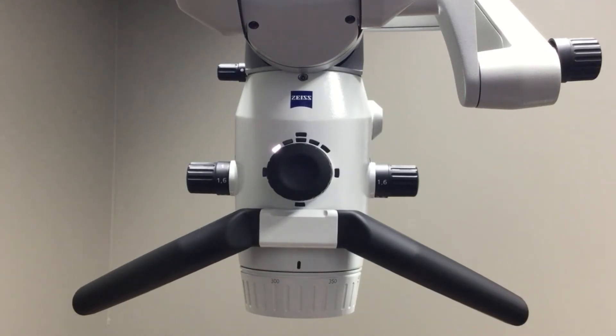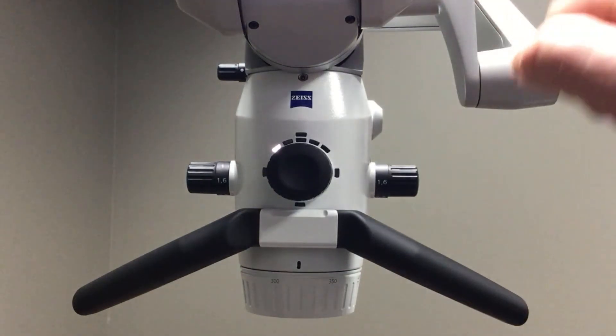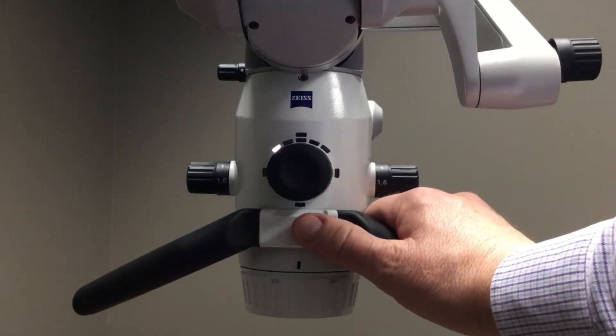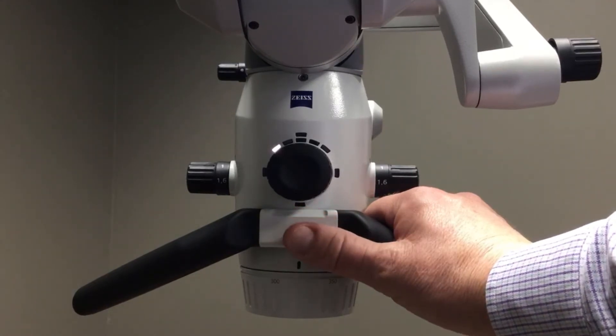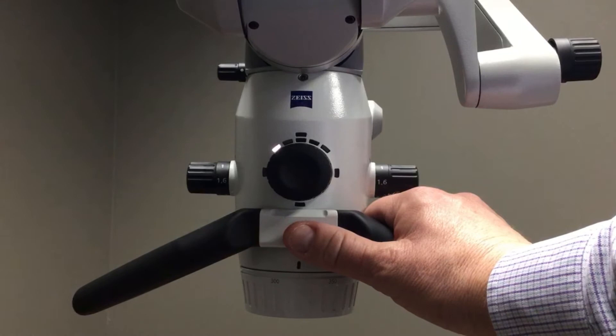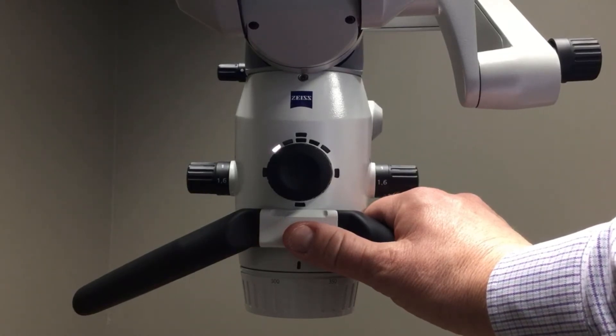The next feature is the hand grip that is designed for ease of use of both left and right-handed doctors. When I grab the microscope handle I can move the binocular head into the proper position.